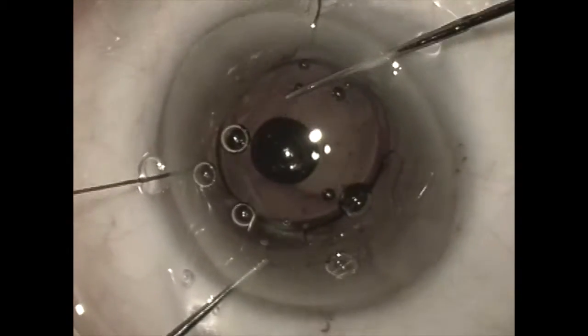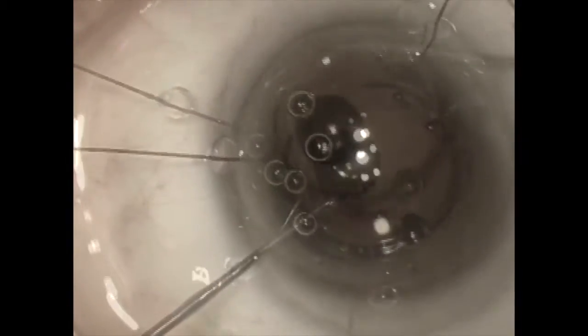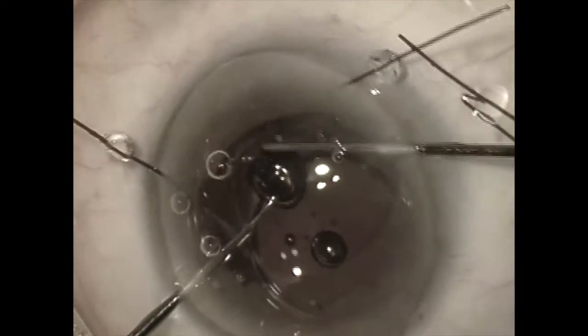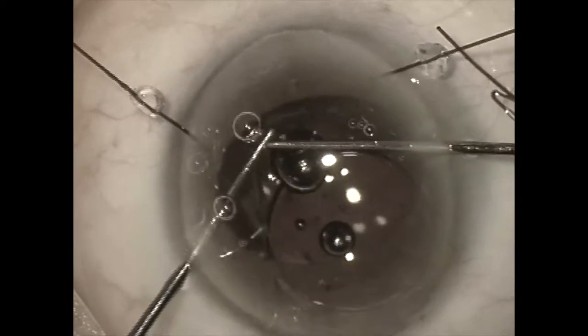Once the haptics are in the sulcus, we are now going to move the lens completely up into the anterior chamber, up over the iris. Two of the iris retractors have been removed to facilitate this maneuver, and this is necessary to cut the lens in half for removal.